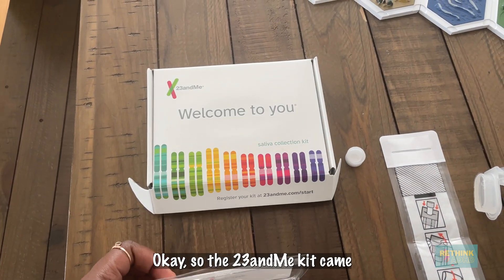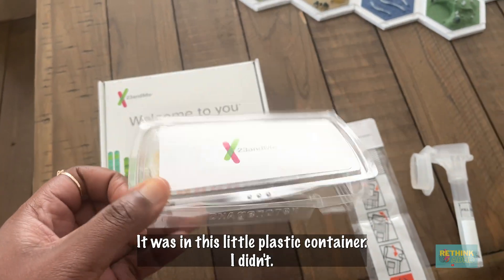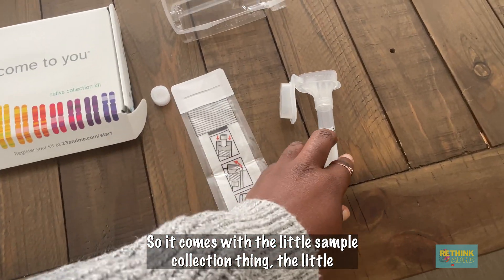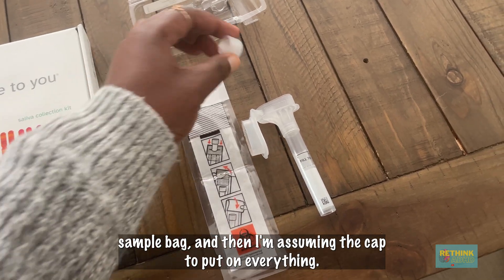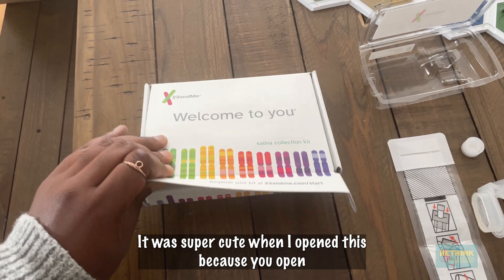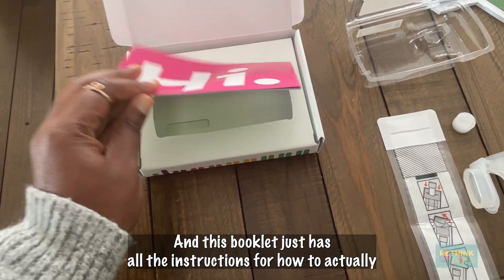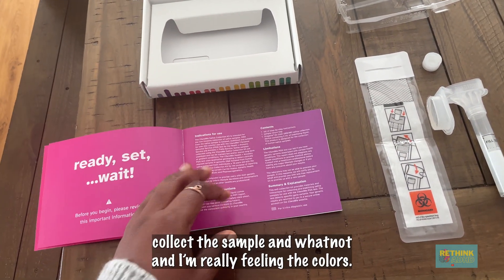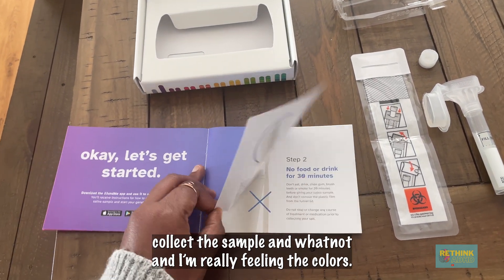So the 23andMe kit came. When I opened up all of this, it was in this little plastic container. I filmed it, but then I was like, maybe I should have done it differently. It comes with a little sample collection thing, the little sample bag, and then the cap to put on everything. It was super cute when I opened this box — it's like, hi. And this booklet just has all the instructions for how to actually collect the sample. I'm really feeling the colors. They're cute.